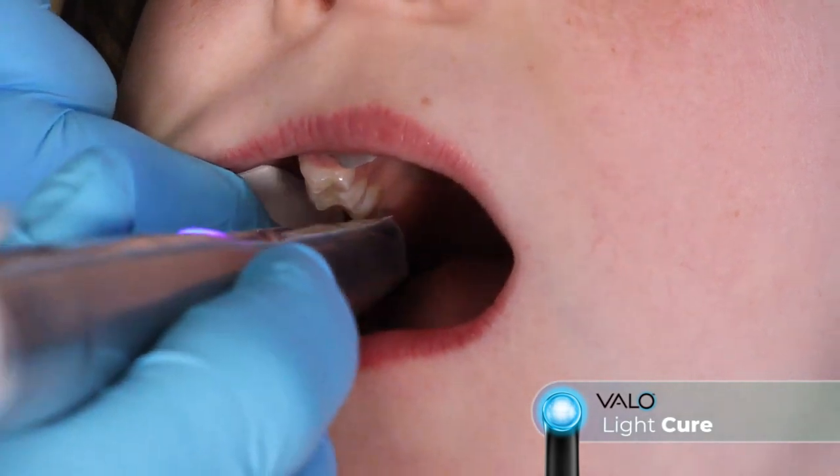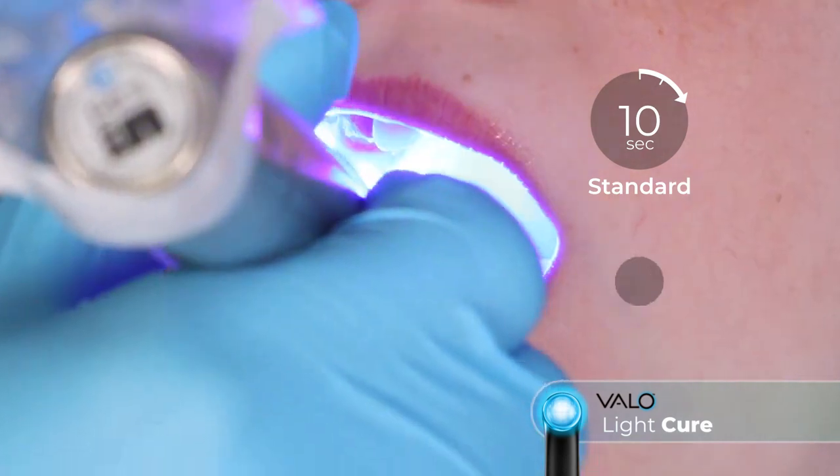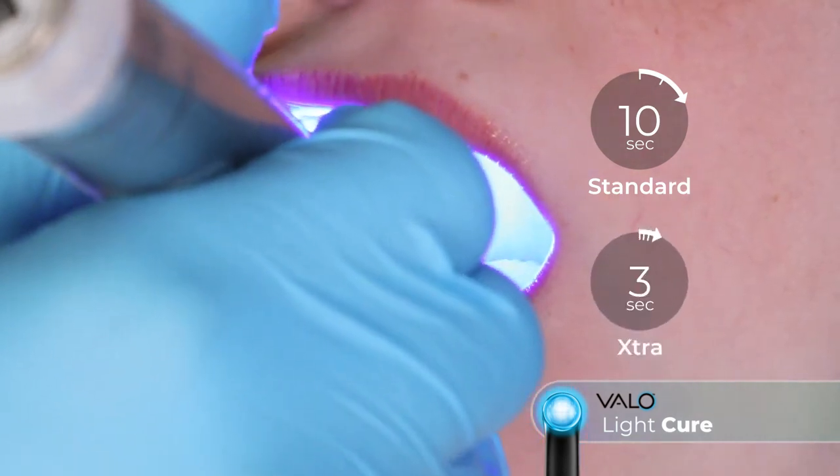Light cure the resin using a VALO LED curing light on standard power for 10 seconds, or for 3 seconds on extra power mode.